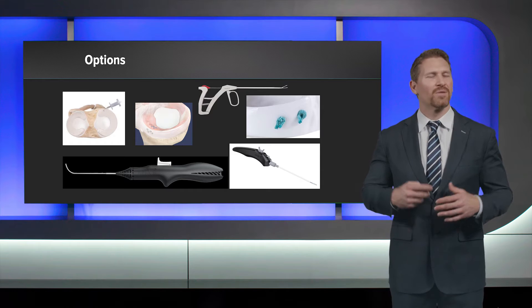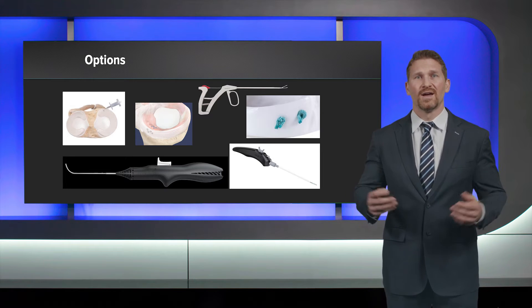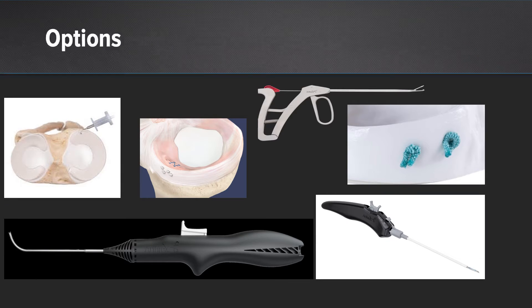For this case where I'm not quite sure where the tear is going to extend, I really want an entire toolbox. Here I'm going to bring all inside with the fiber stitch and the knee scorpion. I'm going to have the ramp lasso available as well as the zone navigator with the inside out mini suture tape.